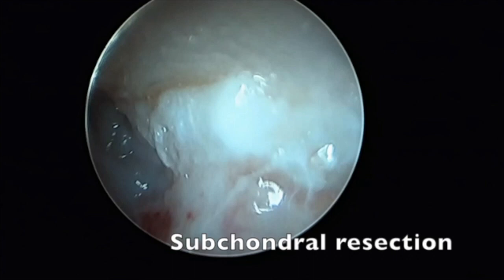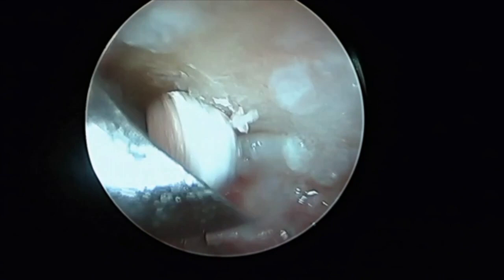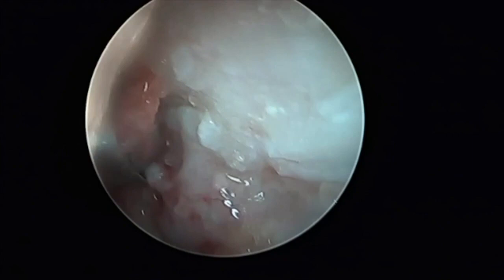Once the reactive synovial hypertrophy has been resected and the joint is clear, resection of the subchondral bone using a 3 mm burr induces a bleeding surface. Only osteoarthritic lesions are resected, leaving every healthy cartilage area in place.